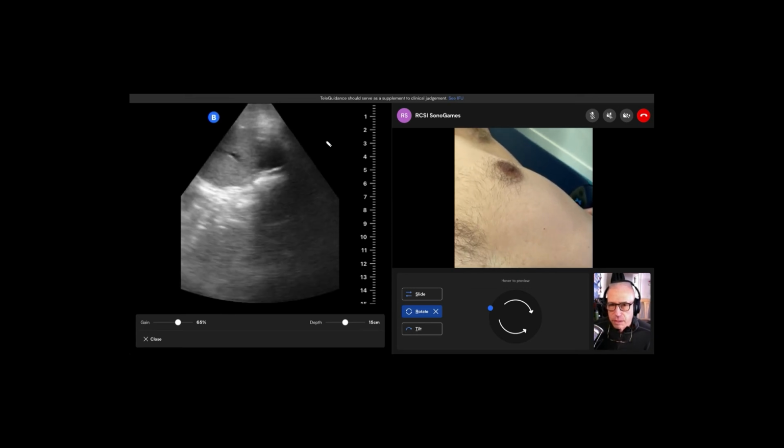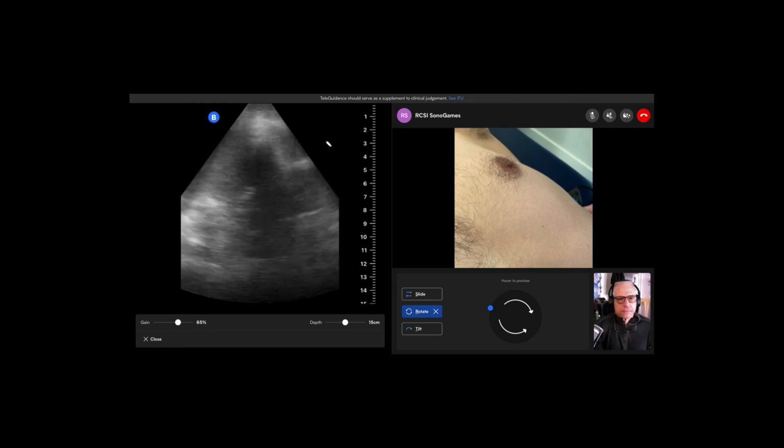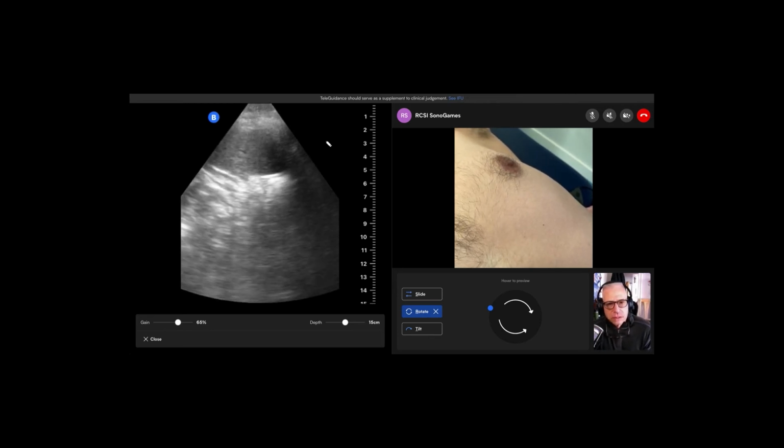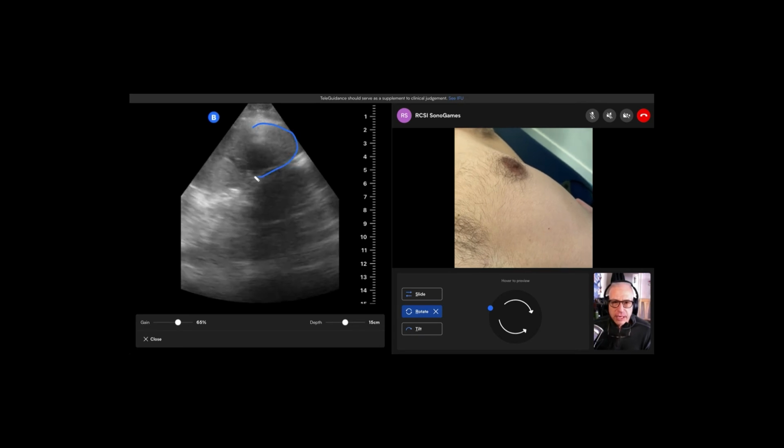So I was trying that, was that right there? Okay, wait. I'm going to make sure I'm looking at the right thing. Okay, so that's definitely the spleen. Yeah, so that's the inferior pole of the spleen right here. You can see it right there.